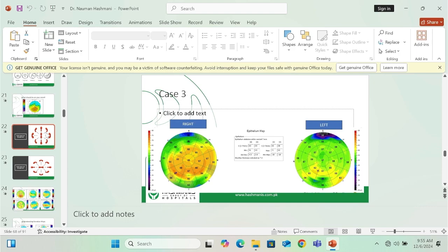And looking at just one parameter, be it OCT or refraction or Pentacam or any other topography machine, is not sufficient. Your thorough clinical examination and history matter. If the patient wears contact lenses, has just taken them off yesterday and you've done the topography, you'll get completely wrong readings, and that's not reliable. So all these points have emphasized that clinical examination and history are absolutely fundamental to any equipment we use in ophthalmology.